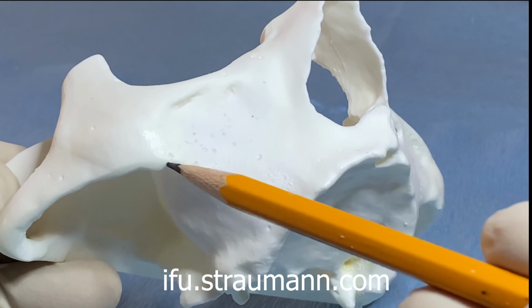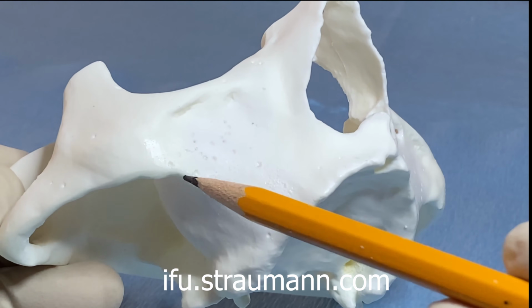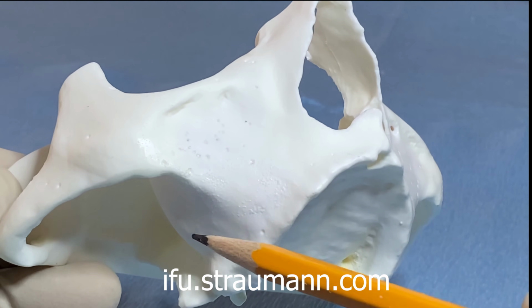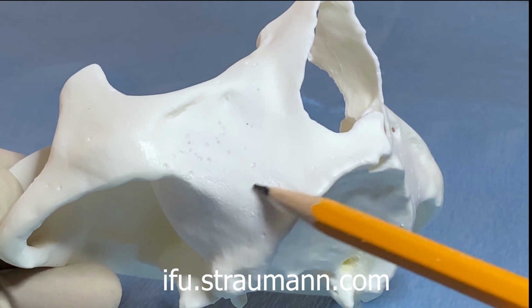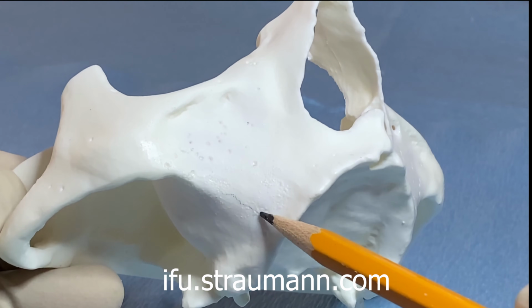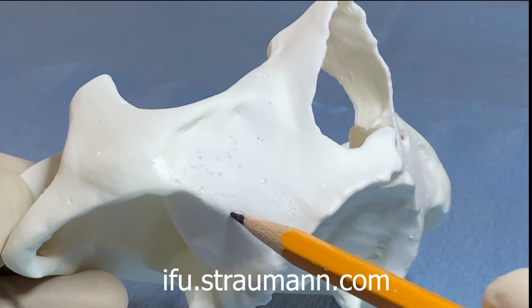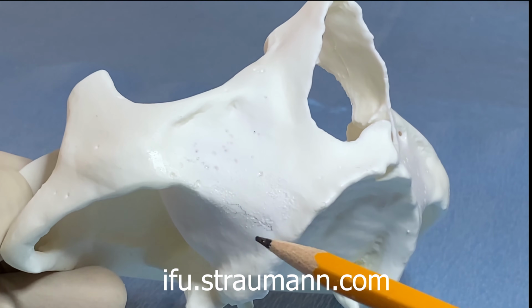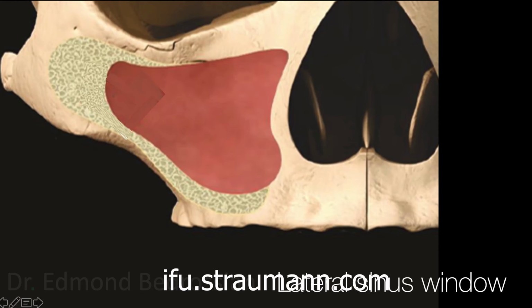The base of the zygoma, the buttress, and then what I call the black dotted line, where the lateral maxillary wall curves and becomes the posterior maxillary wall. So that is right here. This is what I would call the black dotted line. And the more vertical resorption there is, the shorter this distance.